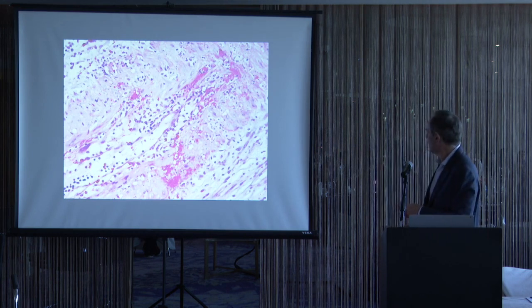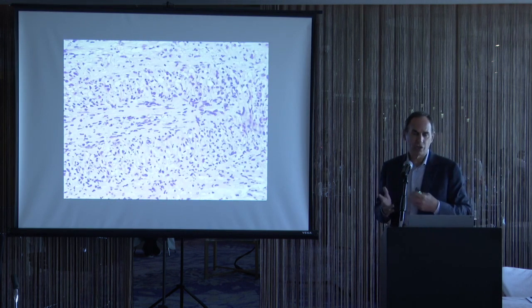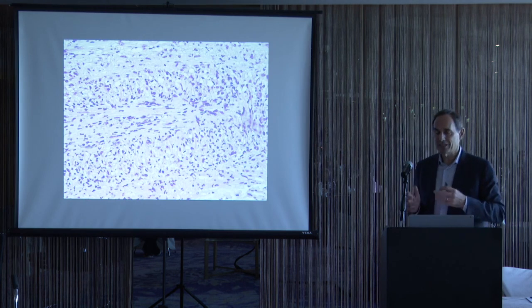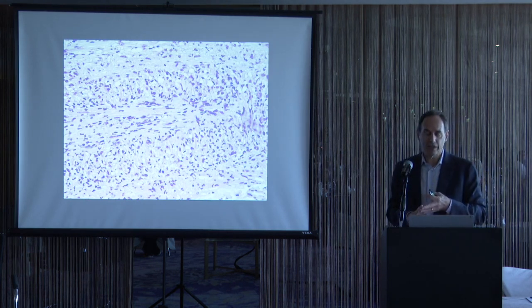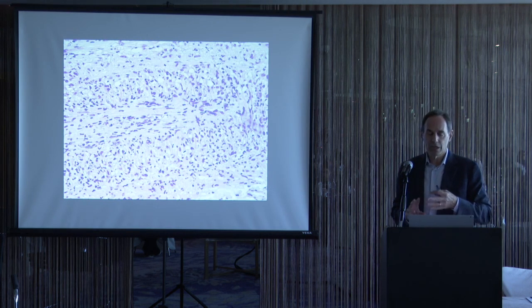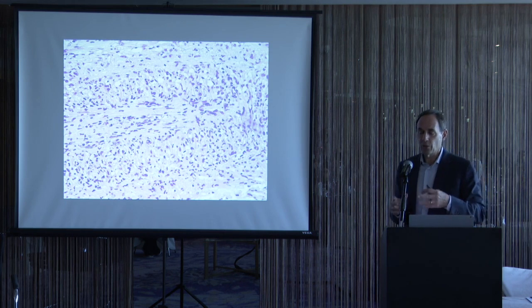Within the vasculitis, often you'll see a lot of karyorectic debris. And this, in contrast, is a granulomatous vasculitis. So if I have a polyarteritis nodosa-like vasculitis, what I will end up putting in a note is that this is most likely restricted to the testes. However, the patient should be evaluated for systemic vasculitis.